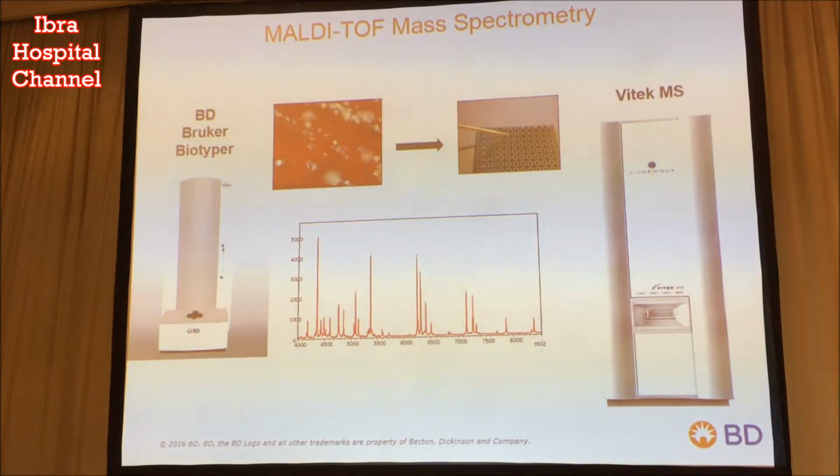I think it's fortunate that biochemical testing is going to disappear, even though I've spent much of my life writing books and giving advice on how to identify organisms biochemically. It turns out that it's not that accurate. And that actually was my fear when I got to the NIH and I decided I would start a sequencing program, because I thought that's the way we would identify organisms. And mass spectrometry really was a secondary consideration, but it turns out to be faster and cheaper and much more accurate. So let me start with a discussion there.